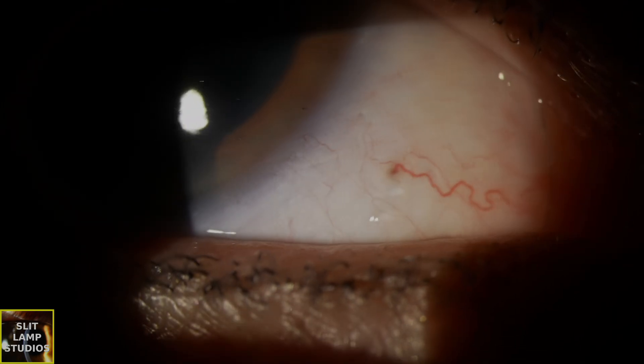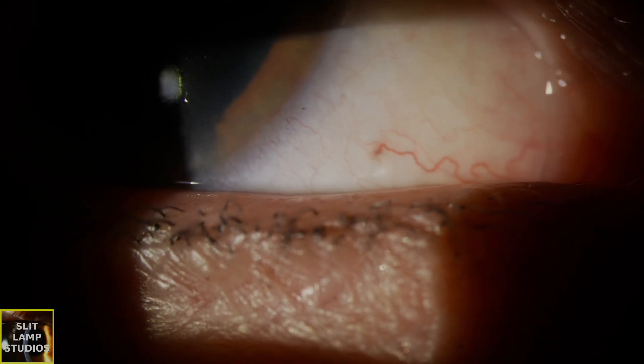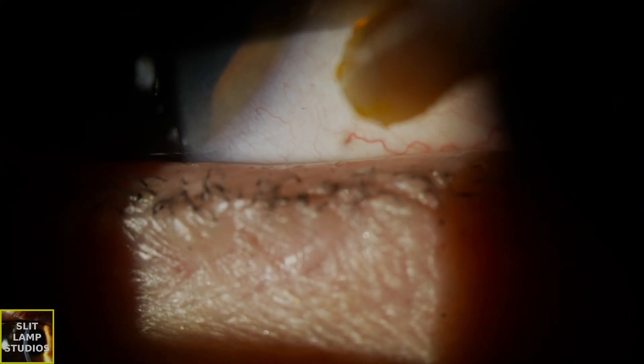It's because fluorescein comes in minims, and there's sometimes a misconception that you need to use the whole fluorescein minim and put that into the eye to adequately stain the cornea.